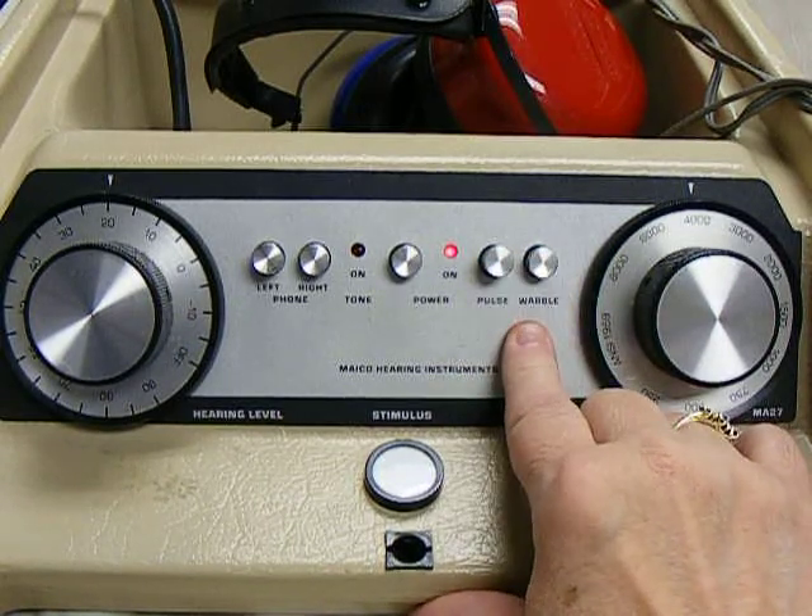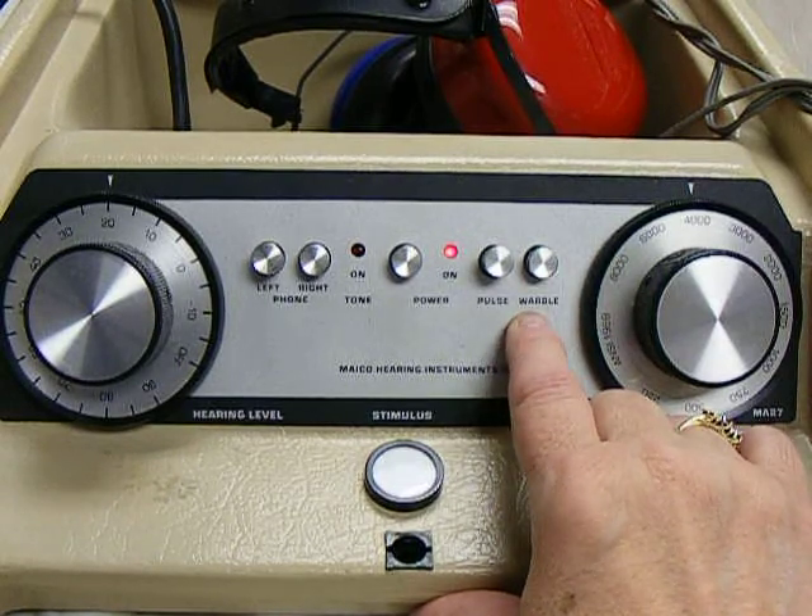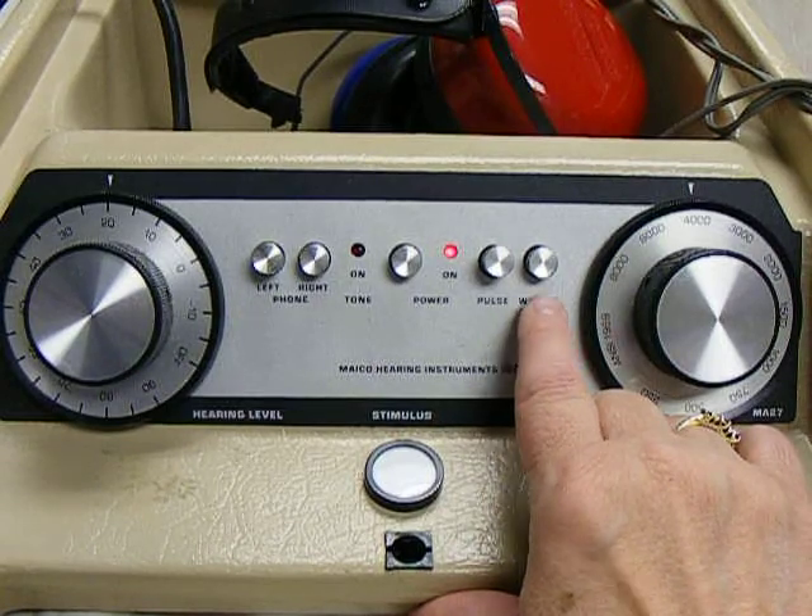This button is a warble tone. We prefer that you use a warble tone because it's easier to hear when background noise is present.